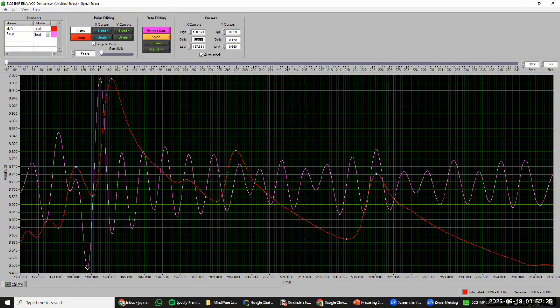So in this case, we are actually below that window that we would find acceptable by quite a bit. It's 525 milliseconds, so it's about half of the latency window that we'd be expecting. So looking for this kind of thing, detecting trough to trough location, how much time can really help us identify that. Again, it's not a perfect science here, and you'll see a lot of different variants in how people will recommend this, but it's a general rule that's very helpful.